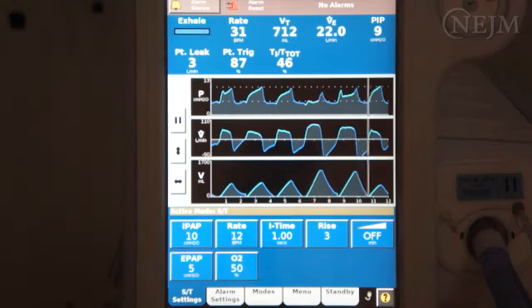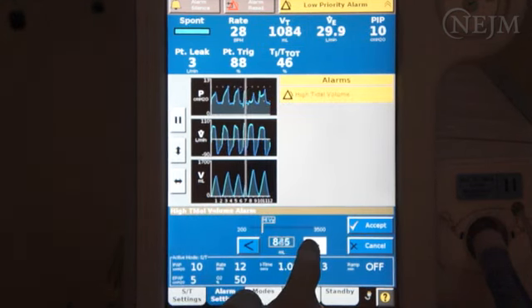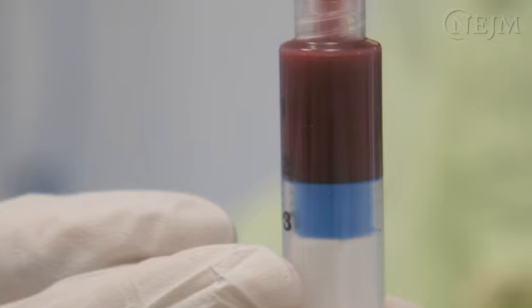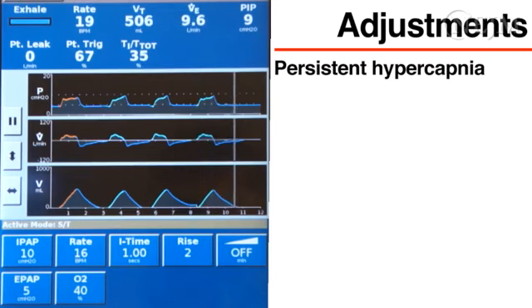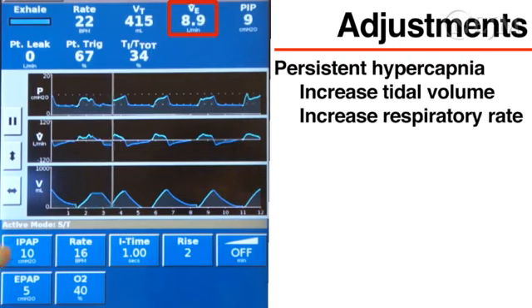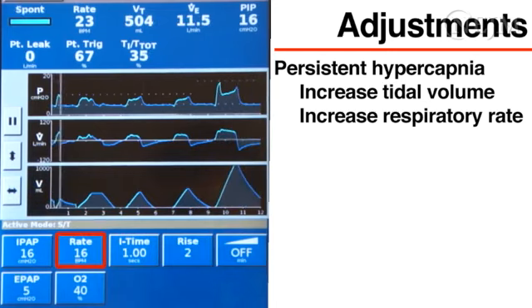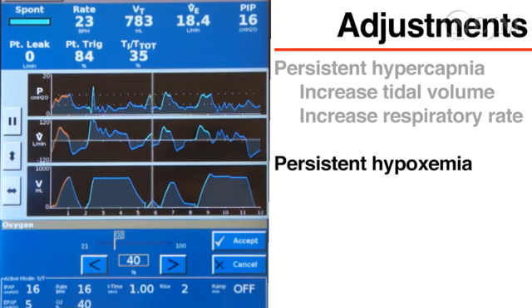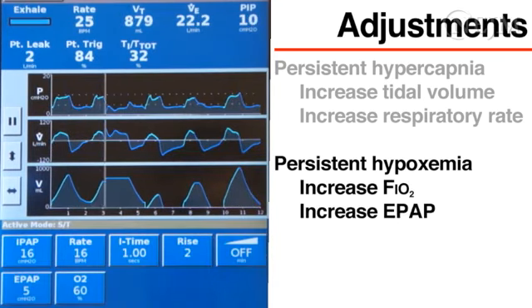Adjust the alarms in accordance with the clinical scenario and ventilator settings. Assess the patient whenever an alarm occurs. If the patient's tidal volume is greater than the high tidal volume alarm threshold but that tidal volume is acceptable, the alarm threshold can be adjusted. Monitor the patient's symptoms and vital signs closely and adjust the FiO2 to achieve the desired oxygen saturation. Measure another arterial blood gas after 30 minutes to determine whether further changes to the ventilator settings are required. If there is persistent hypercapnia, increase the minute ventilation by changing either the tidal volume or the respiratory rate — recall that the tidal volume will increase as the difference between IPAP and EPAP increases. If there is persistent hypoxemia, increase either the FiO2 or the EPAP, noting that if the EPAP is increased, the IPAP should be increased proportionally so that the amount of pressure support does not change.